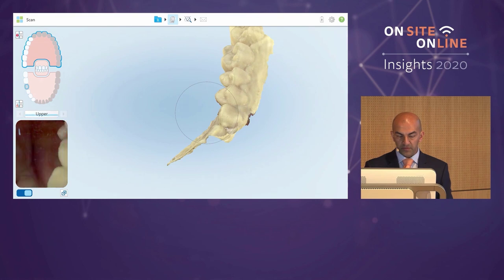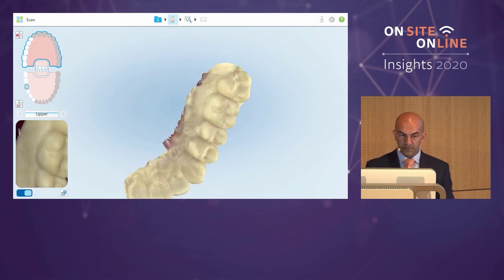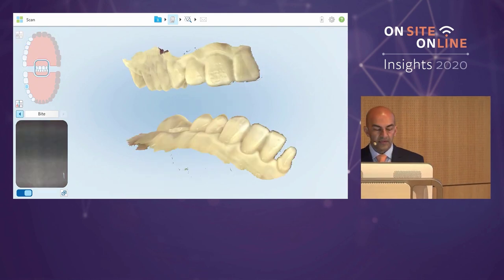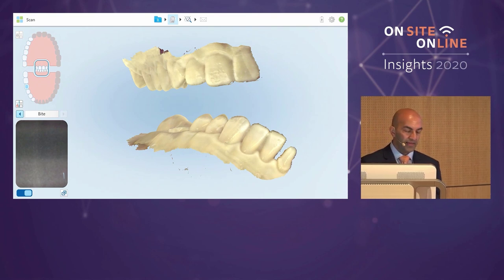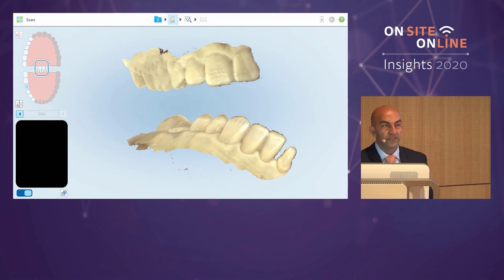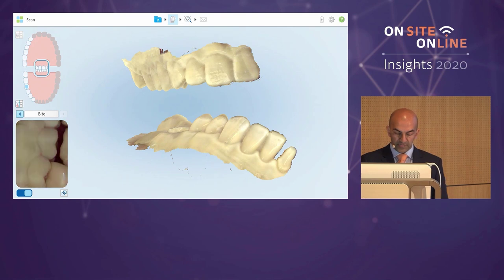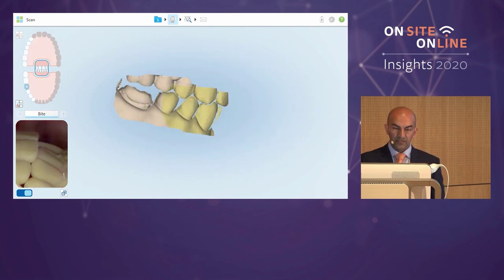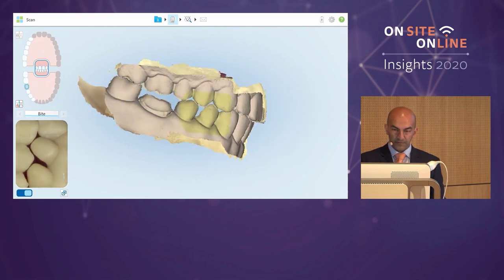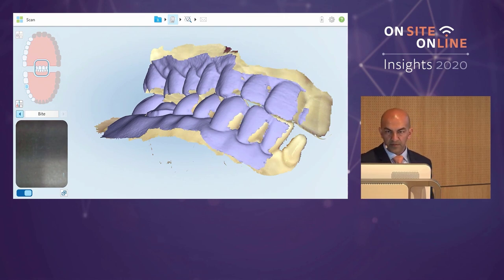This is our opposing model. I don't need a huge amount of detail, just picking up to the centrals. Next it's asking for the bite registration. From a clinical point of view, it's really important that the patient bites on their back teeth. Many problems occur when patients think they should open — they shouldn't; they should be tightly closed. Simple things like that ensure the occlusion is correct and you don't have lots of adjustments when fitting.